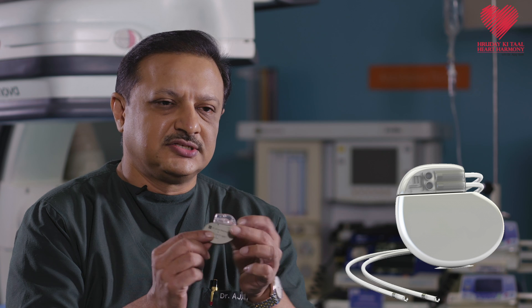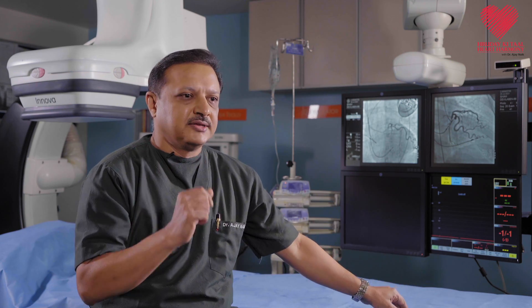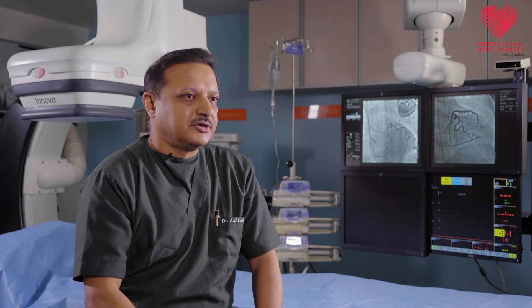Typically a pacemaker would be this size — just the size of a small coin. The procedure is performed in a cath lab or room like this. It is sterilized and fumigated and done in controlled conditions.